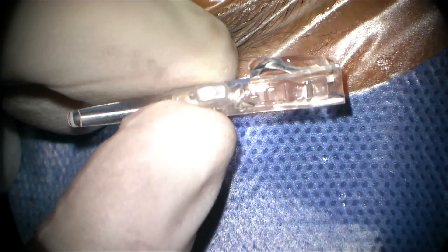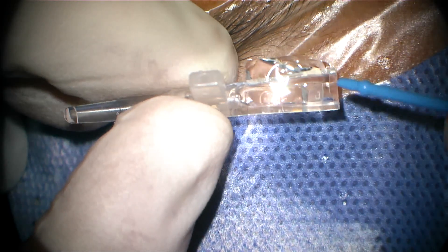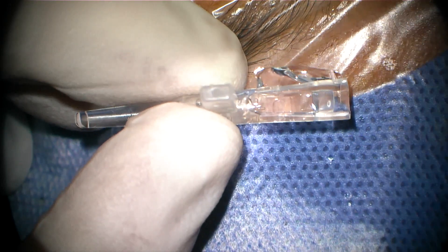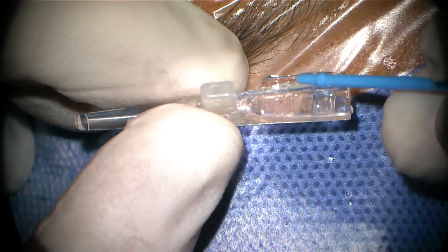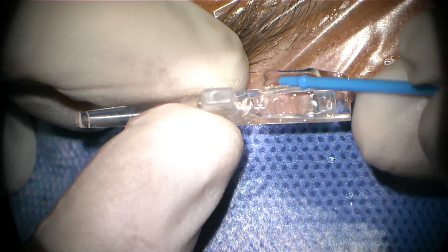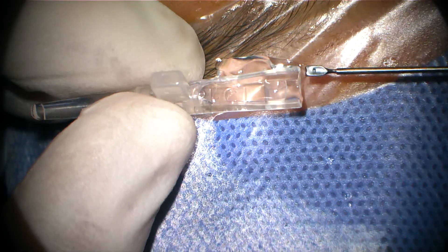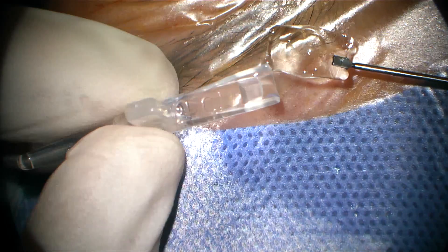The lens should be placed in the correct position: the convexity of the lens should be up and the concavity should be down. Sometimes it's difficult to confirm this, but you can verify the correct position by looking at the small knobs at the angle of the haptic. Let me show you — you can see a very small, faint knob on the haptic.